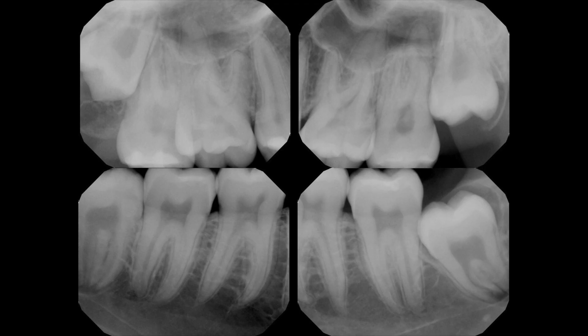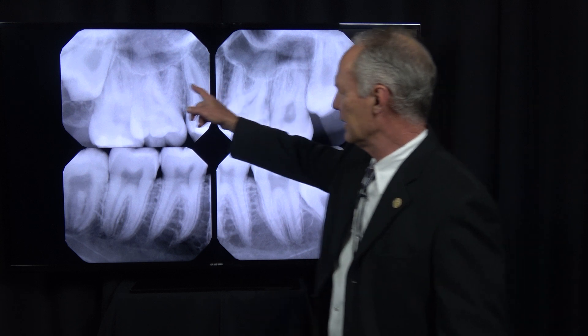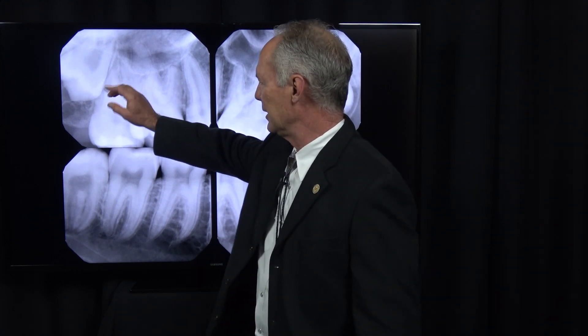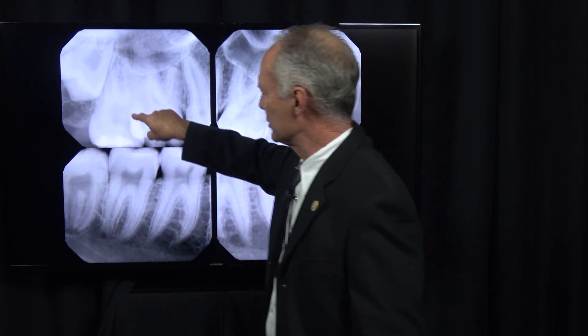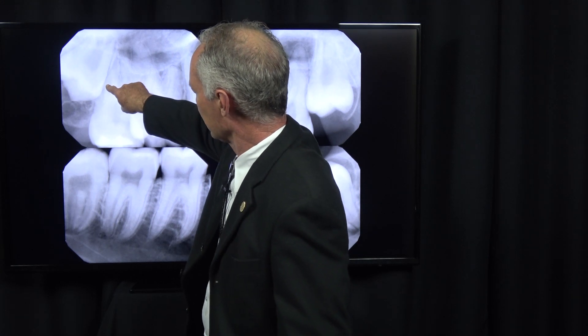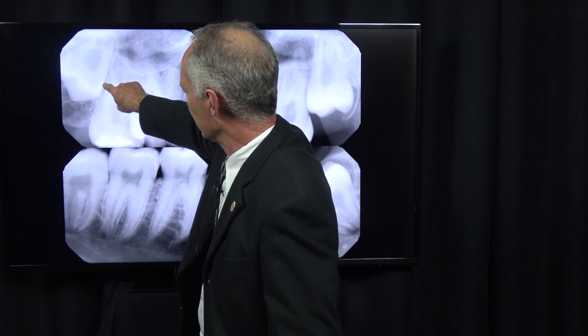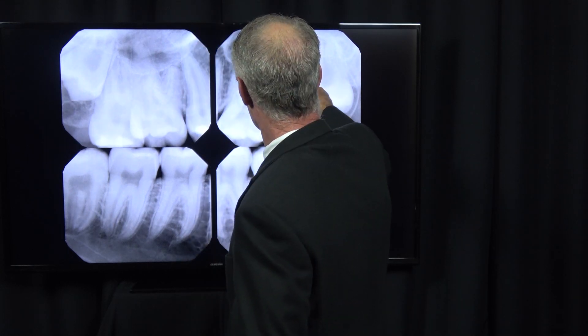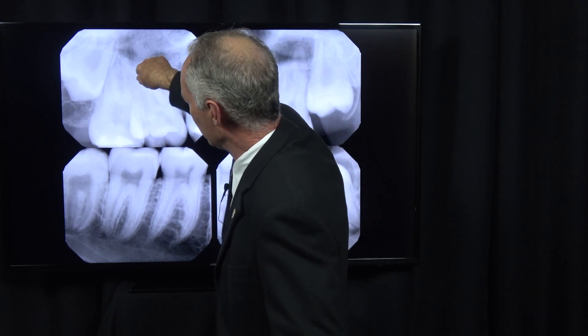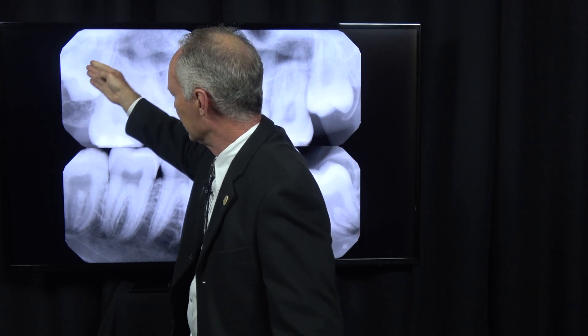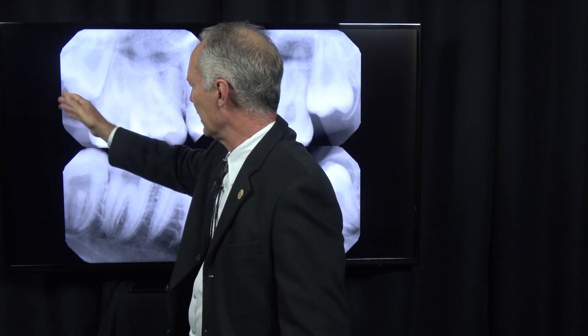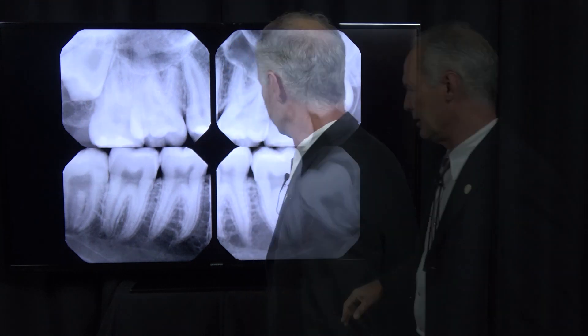Let's do a skull drill before we start. These maxillary wisdom teeth should be fairly straightforward. We'll just place a periodontal elevator here and here and begin the elevation. Then come back with a 301 elevator and the tooth should just roll right out. Be sure you put a 2x2 in the mouth to protect the airway on both sides.